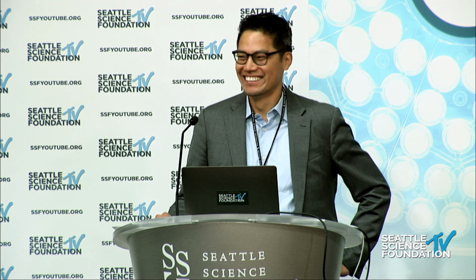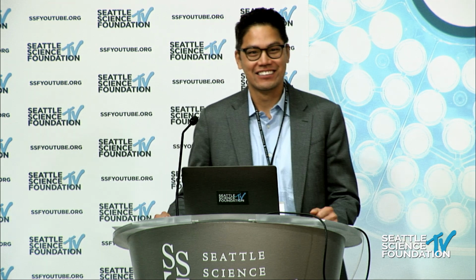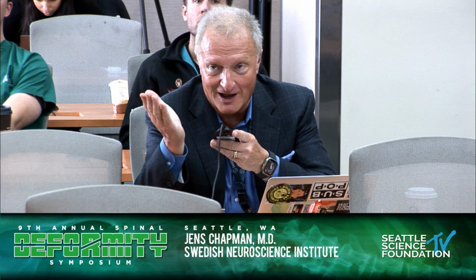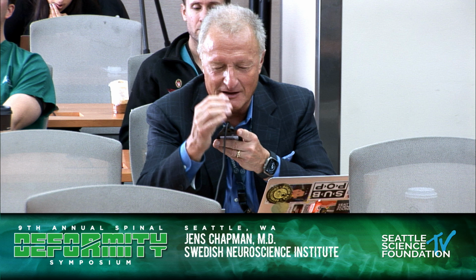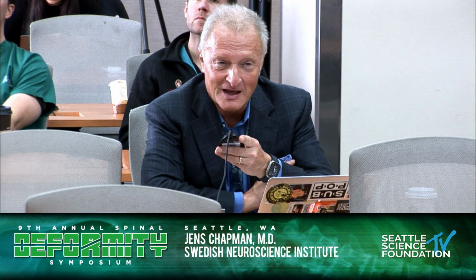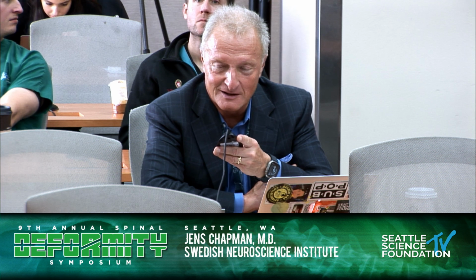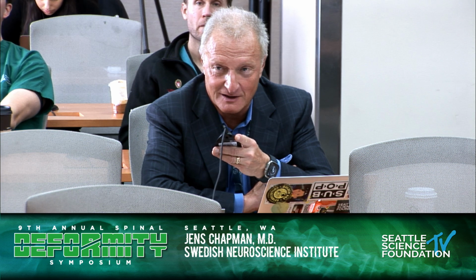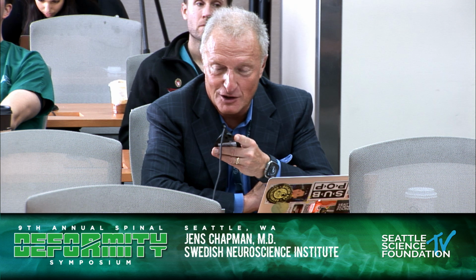Yeah, okay. That was an excellent talk, thank you. There are companies that try to sell us pre-contoured rods with alleged less notch sensitivity to meet our alignment goals. What do you think of those, and what do you think about all this focus on making us more dependent upon technology rather than good surgical craftsmanship? Is that a worthwhile thing? I hear these reports of people who have these pre-contoured rods, no names given here, and they have about three or four of them on the field, throw them away, and then bring out the good old French benders. So, what do you think about that?